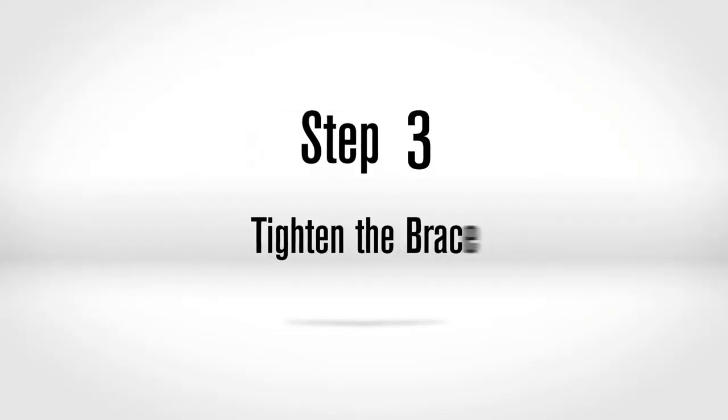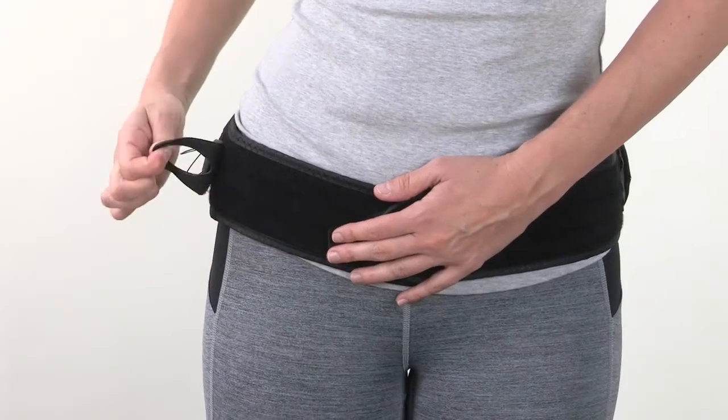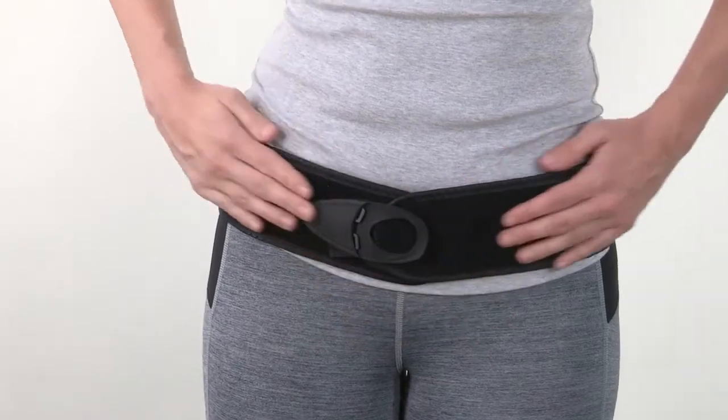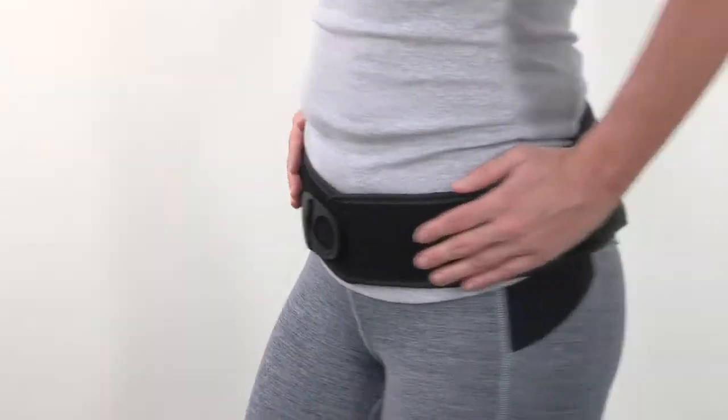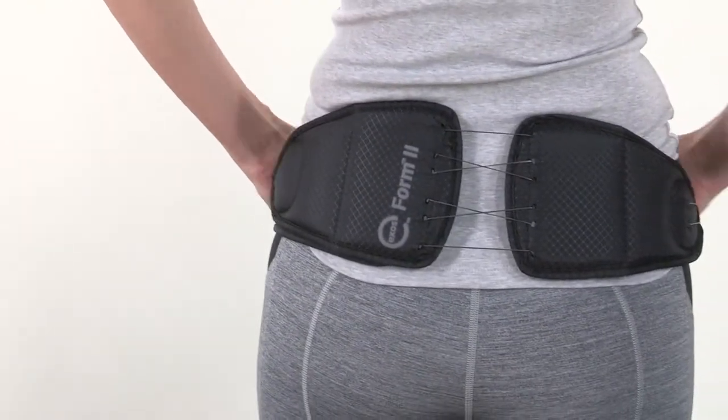Step 3: Tighten the brace. Grasp the pull tab and pull away from the body until reaching the desired compression, then secure the pull tab to the belt wing. Note: before tightening the brace, make sure the rear panel section is positioned evenly on both sides.